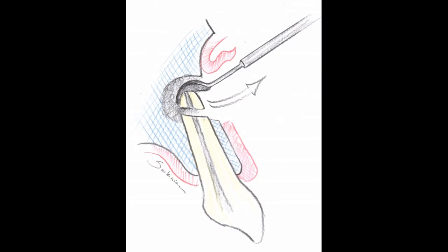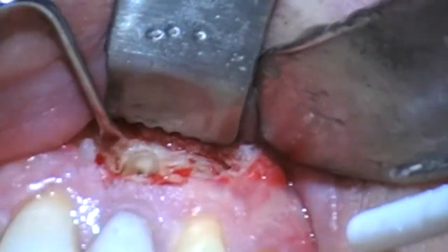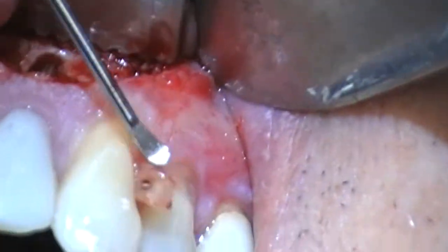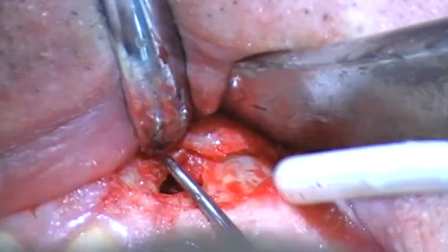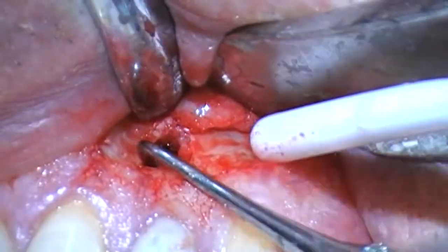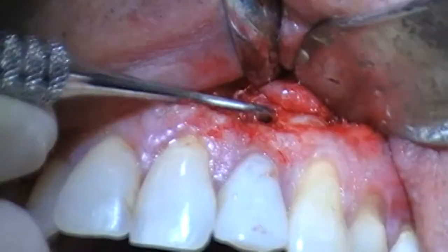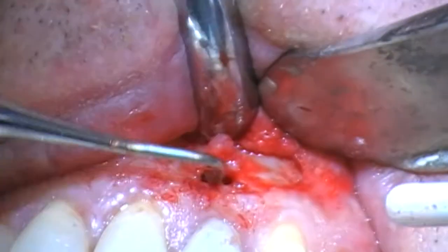Once we are through with the laser, we break the tip of the root out of the bone lesion and we start curating. It's very important to curate every little piece of granulation tissue from the bone. The granulation tissue is very tenacious — you think you've got it all, but you haven't. You keep curating and there's more and more coming out. If at some point you feel like there are too many undercuts and you can't get to it all, just make the bone window a little larger. Don't forget to reach behind the little root stub that is sticking into the bone lesion, which shouldn't be more than one millimeter.